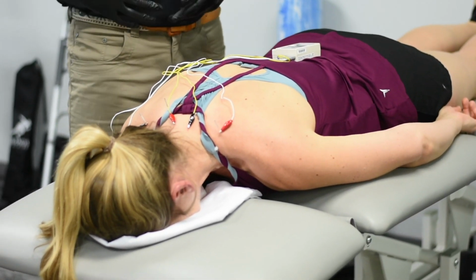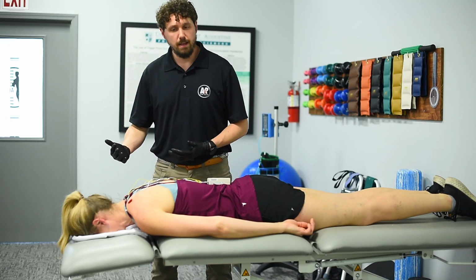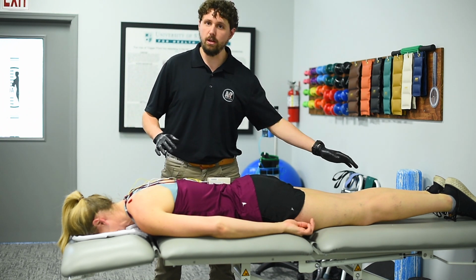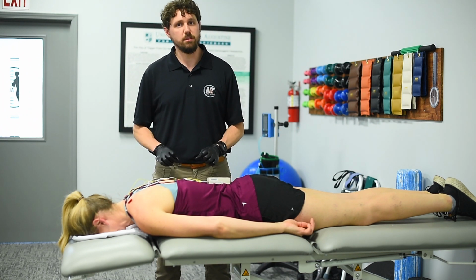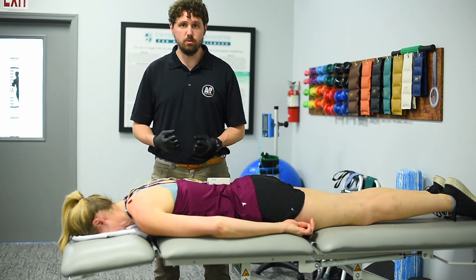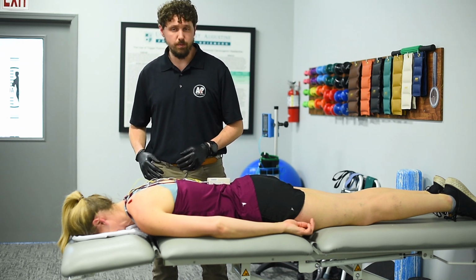Then we'll come back, and after that usually we'll do some heat or something like that to help those muscles relax. But basically that's dry needling. I can use this just about anywhere in the body, any muscle. We go down to the legs. I do this all throughout the spine. So it's got a lot of good uses, something I use throughout the day, every day. I find it to be a very effective tool.